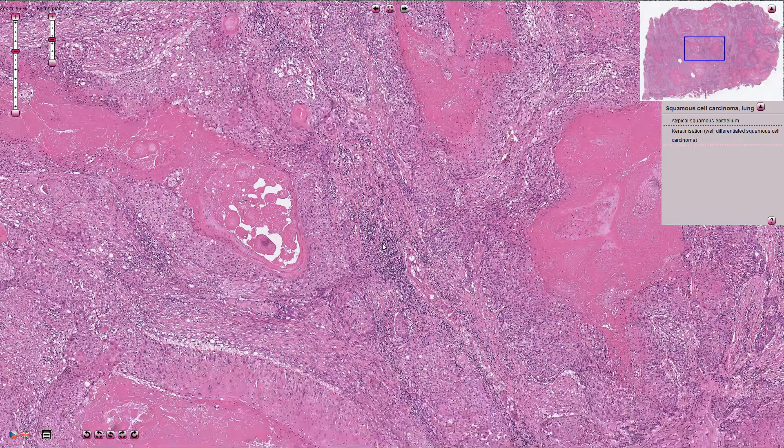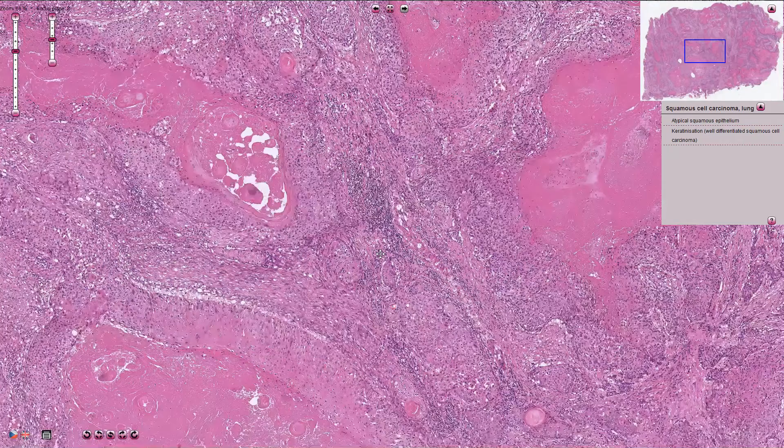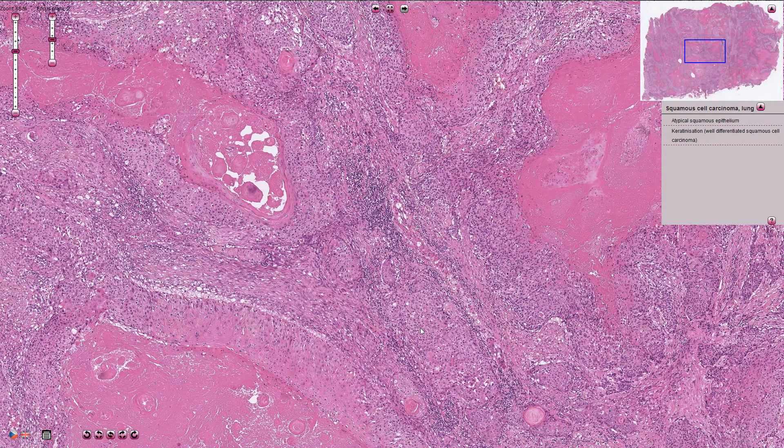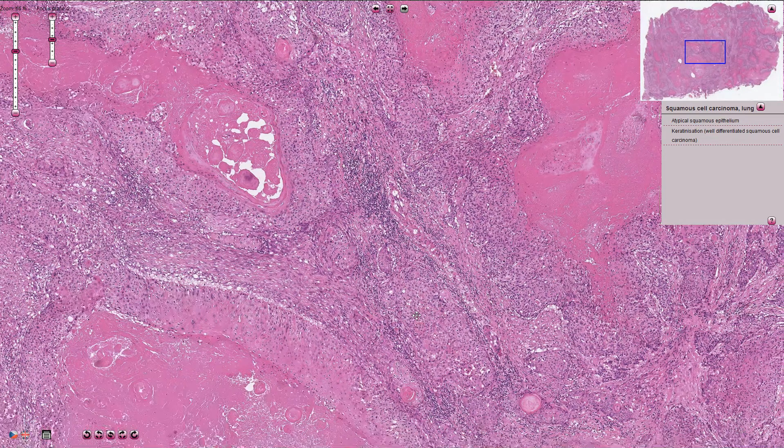So this is squamous cell carcinoma — one of the reasons why I quit smoking before it's too late.